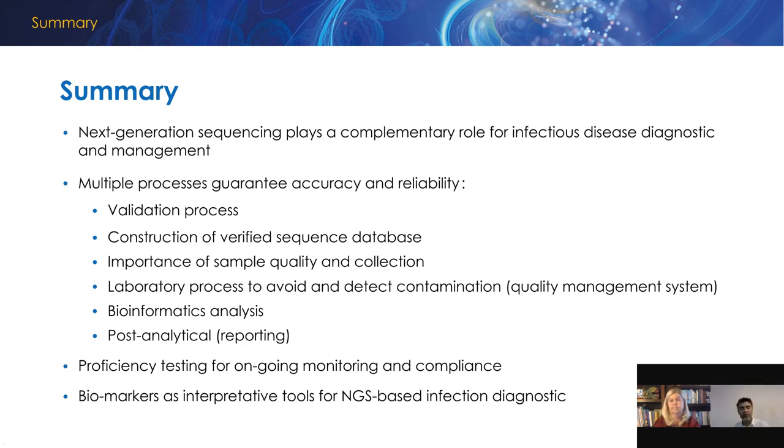So for hospitals, at the final step of the analytical process, that is the bioinformatics, the data analysis, that is probably the biggest barrier that we have. We need to be able to not only have molecular technologists or even microbiologists who work in infectious disease, but staff dedicated to bioinformatic analysis to provide statistical analysis and an accurate identification of those organisms. That's probably the biggest barrier that we have, but it's possible.